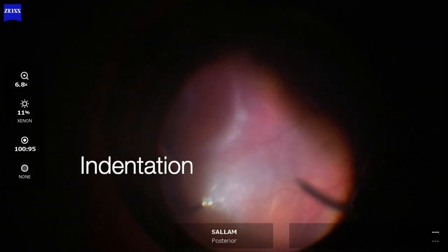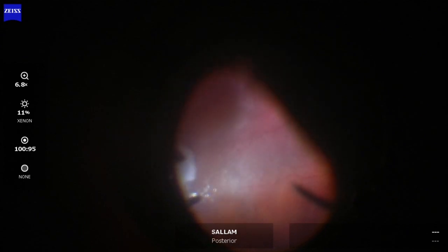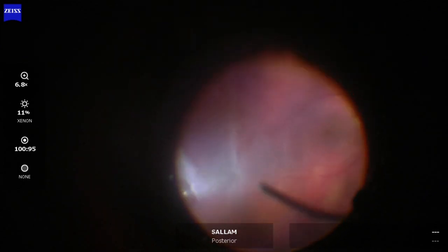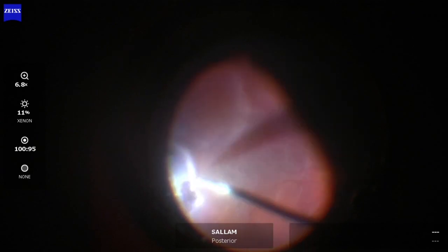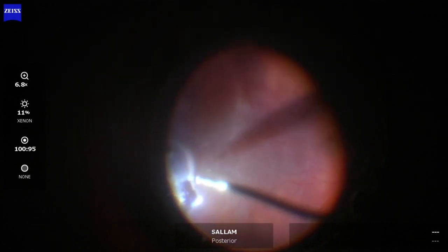Now this is another point where I needed indentation to mark the break before putting air inside the eye to flatten the retina. Indentation is done again — that's self-indentation — and I'm marking the edges of the break with diathermy.